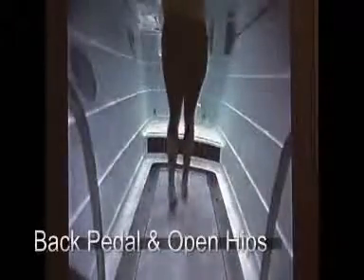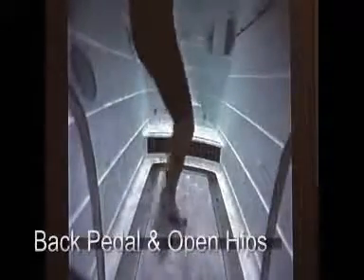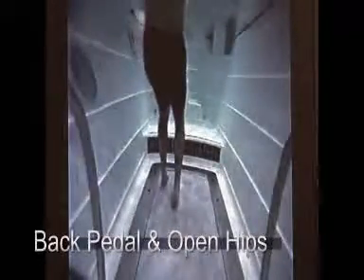And this is closer to a hockey stride as far as trying to get a little bit more abduction, trying to get the legs a little bit wider apart, a little bit more hockey specific. Probably should be crouched a little bit lower, but I suppose with the water height, it depends on how tall you are, if you can crouch down or not. Trying to mimic a little bit skating backwards and then opening up the hips. And obviously that's a major part of hockey, being able to open up your hips like that. Just trying to mimic that movement.